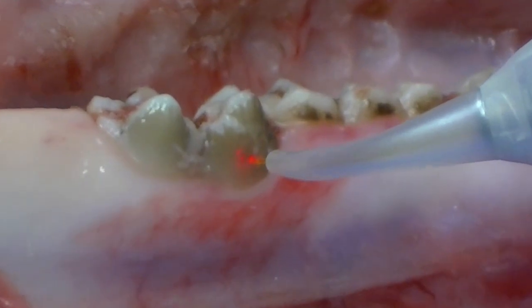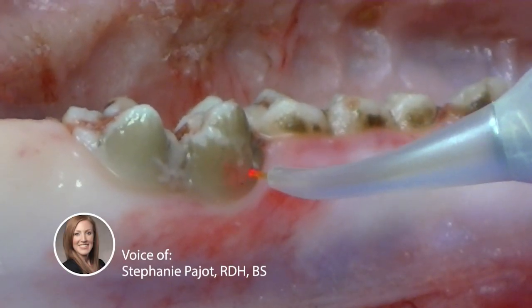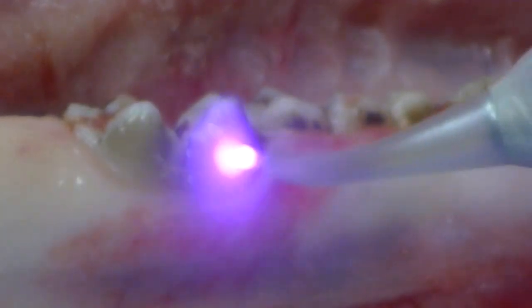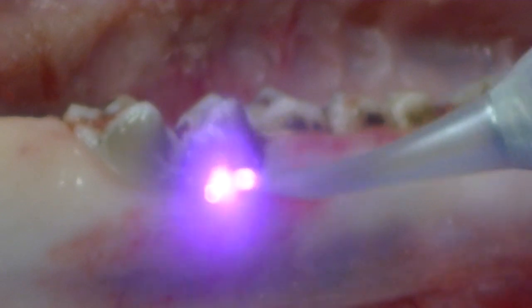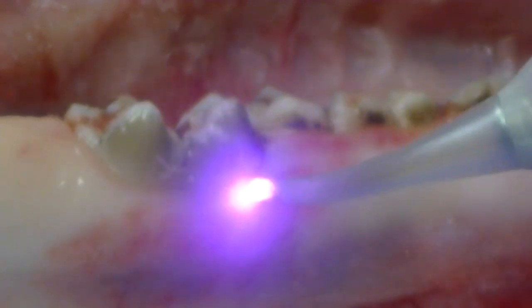You're going to come at the tooth — let's say it's this area here, those lovely root surfaces that are exposed — and you're just going to keep that tip moving, just like you would with something like a canker sore or a cold sore, and just keep it going. It's the same setting; I believe it's 0.8 for desensitization.